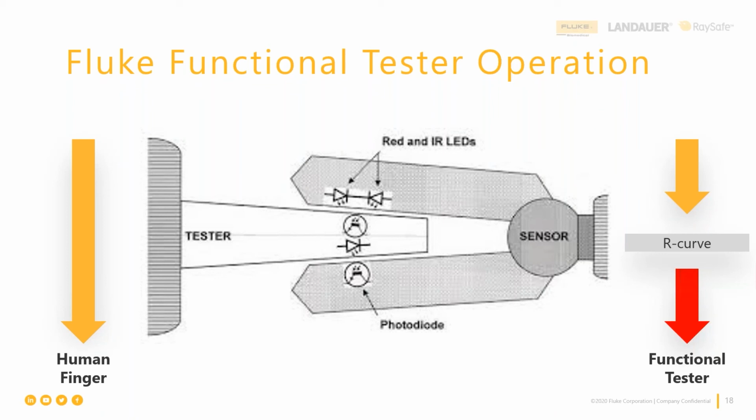The tester is running heartbeat pulses that approximate the shape of the arterial pulse, because remember we said the oximeter must have pulsatile arterial blood flow. It has to have it, otherwise it can't give you a valid reading. So it varies the light according to the current amplitude of the pulse. Between pulses, it just gives DC light, and during the pulse, it gives the AC plus DC light, meaning it gives pulsatile information so that the pulse oximeter can respond properly. That's how the technology works for your tester.